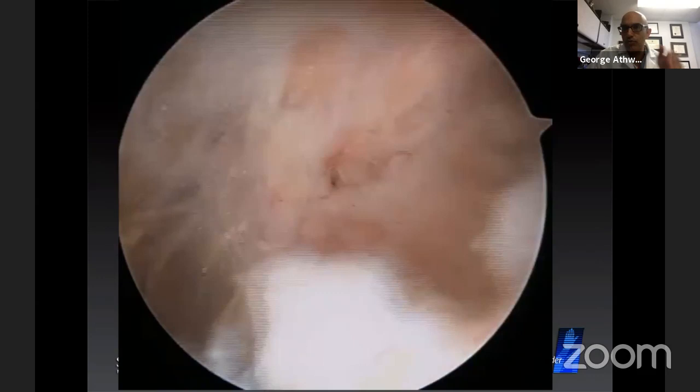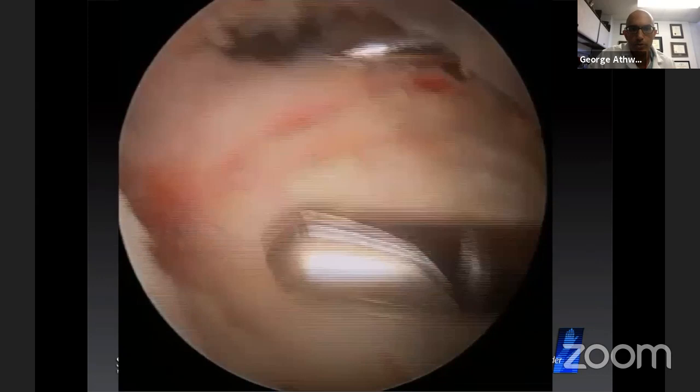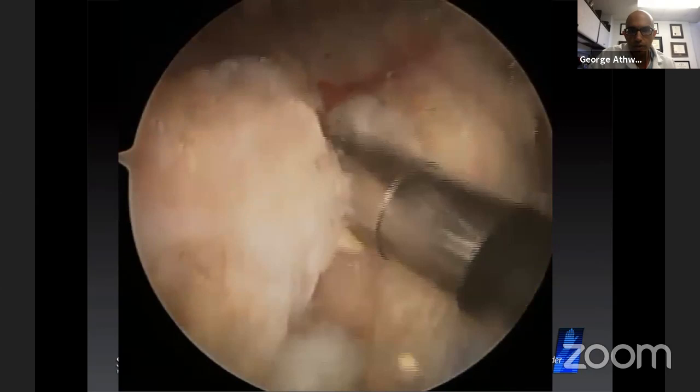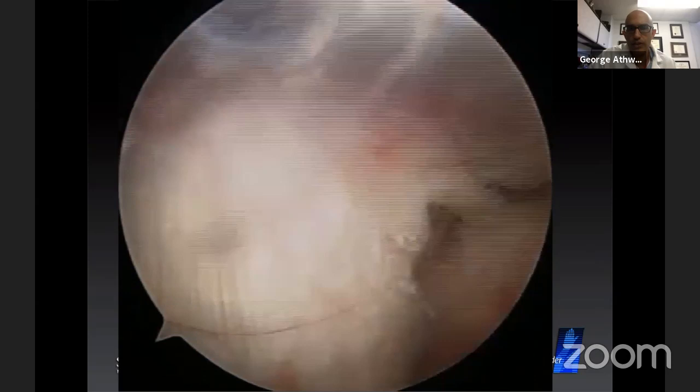So now we're viewing from a delta pectoral portal and we're looking directly at the shoulder, looking directly at the subscapularis. So we're going to remove some of this bursa. I'll show you the anatomy. There's the biceps groove viewed from the front. So we're just going to clean out the groove and do a biceps tenodesis. It's already been done. There's the CA ligament, the conjoint tendon. This is the superficial aspect of the coracoid.